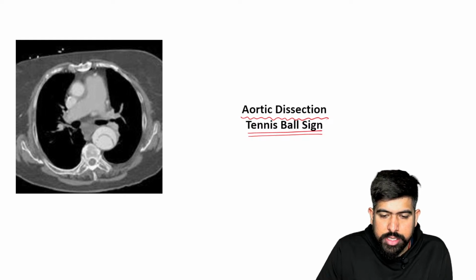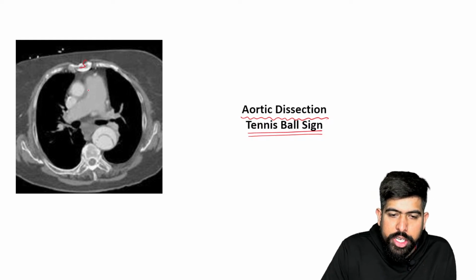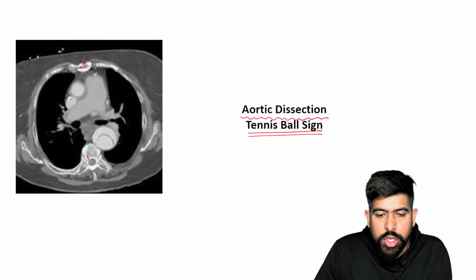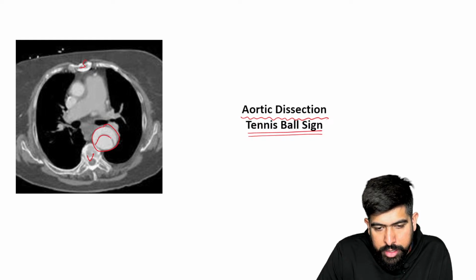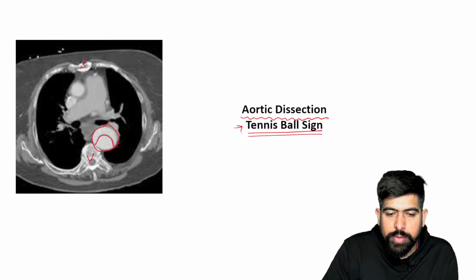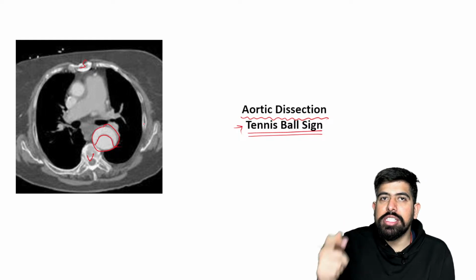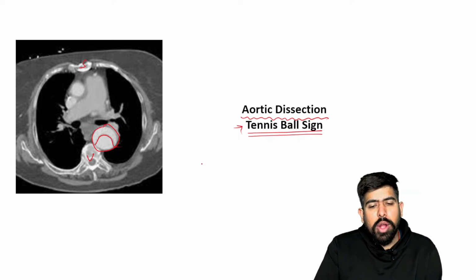So in the image of aortic dissection, you can see that this is your sternum. I already showed you in the image, right? And the question had the same image, right? This is your vertebrae, and this is your aorta. You can see the aorta is having the dissection here. Yes, it is splitting here. So this is your tennis ball sign. It is looking like the same tennis ball, right? Our tennis ball has white strips, right? The green color is the ball, and we have the strips over it. So it's looking the same. Okay, this is the tennis ball sign.